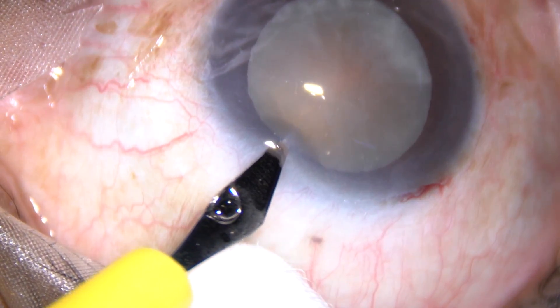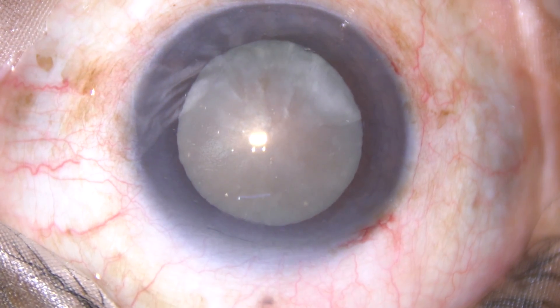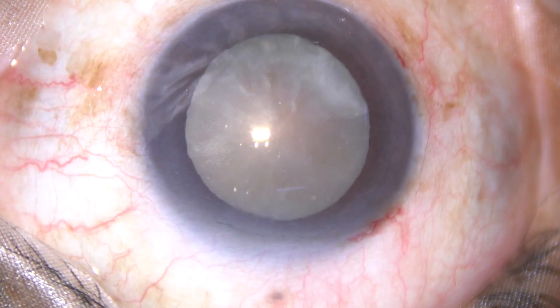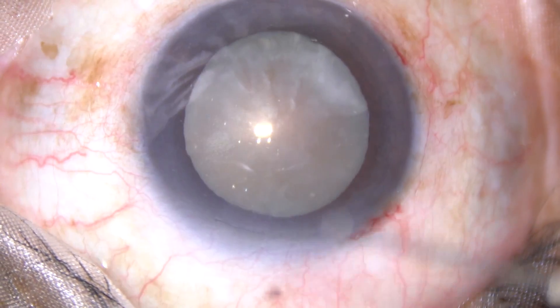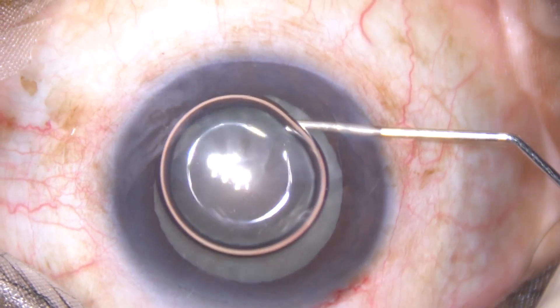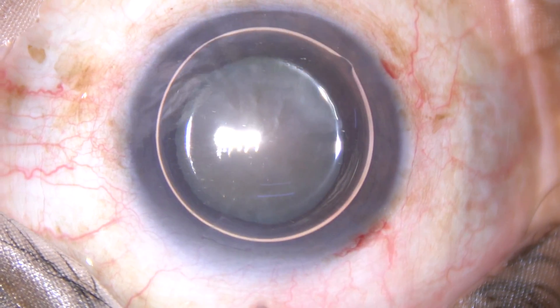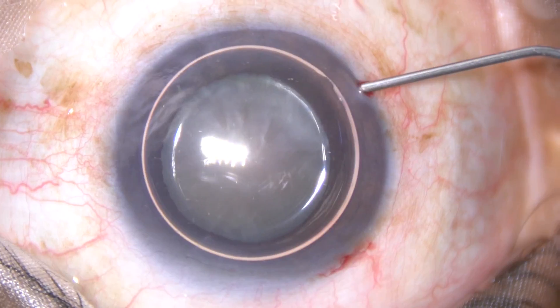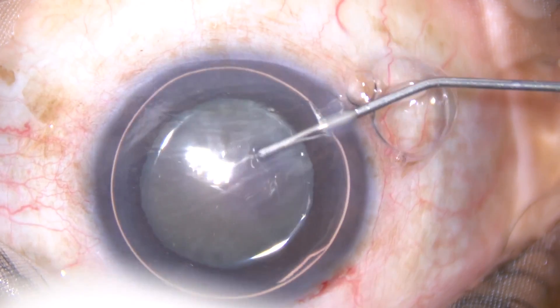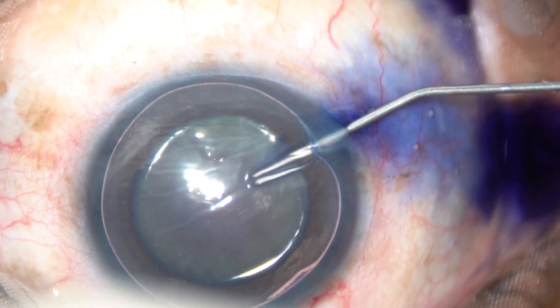Friends and colleagues, watch this minimally edited video of about 12 minutes duration. This is a hard, hypermature cataract. The patient is an elderly lady of 78 years. By this time all the incisions have been made and now the anterior capsule of this cataractous lens is being stained with trypan blue dye underneath a big air bubble.